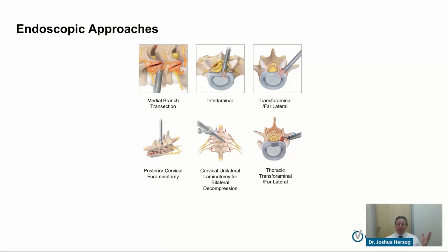And of course, orthopedic surgeons have been using it in the joints; we call that arthroscopy. It's a very similar approach. We're taking a camera or a scope with a tube, using that camera to see, and then possibly doing some work around that joint or space to make something better.